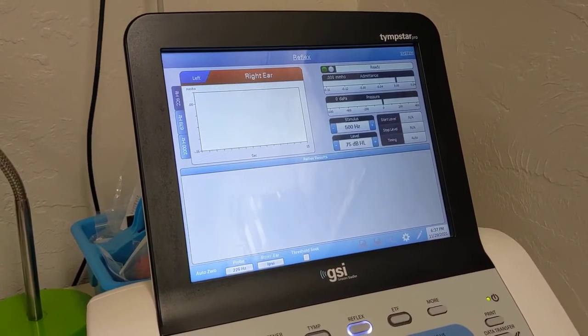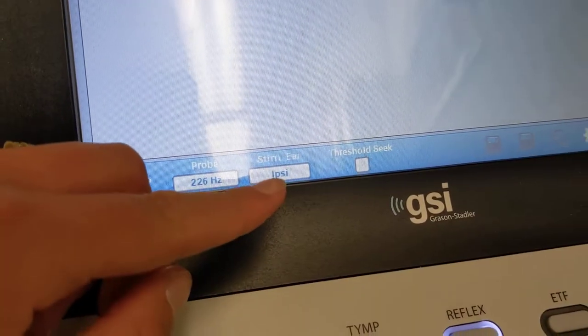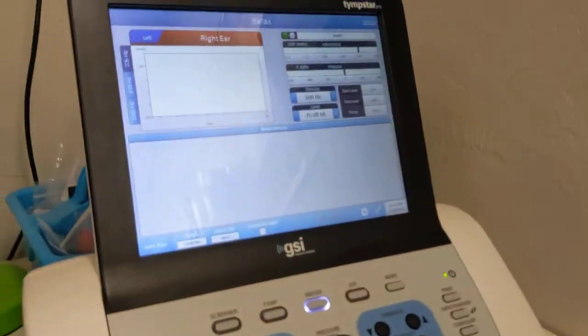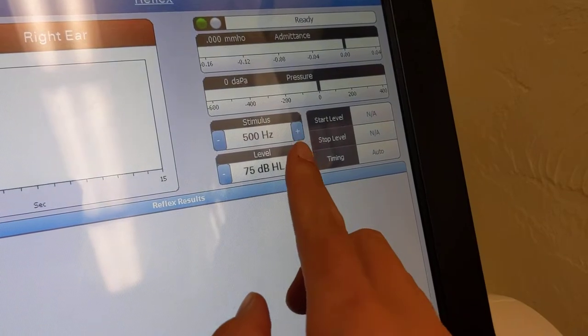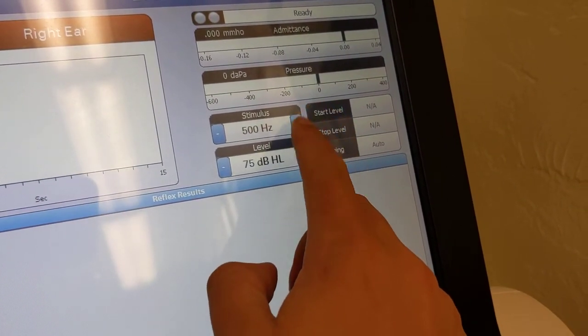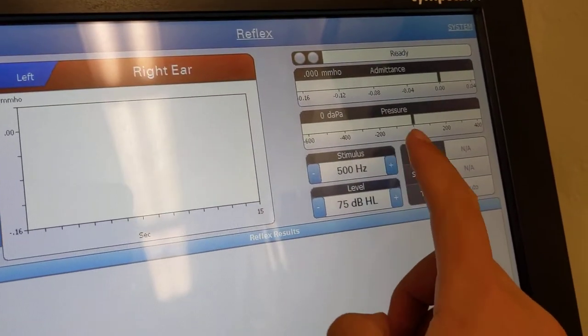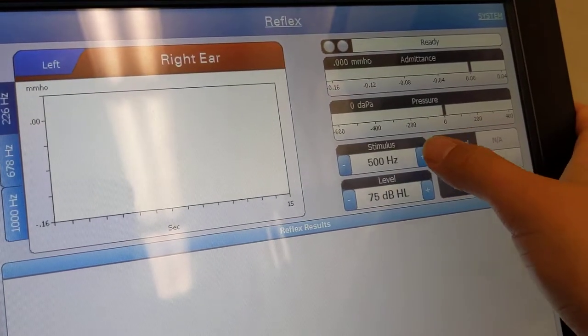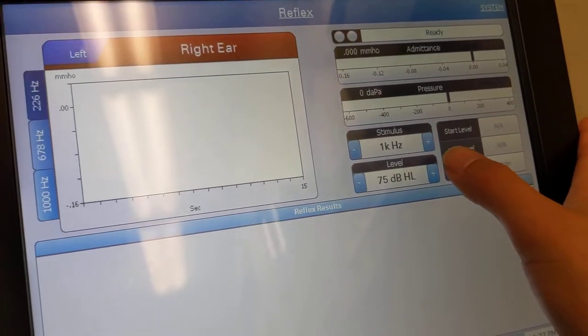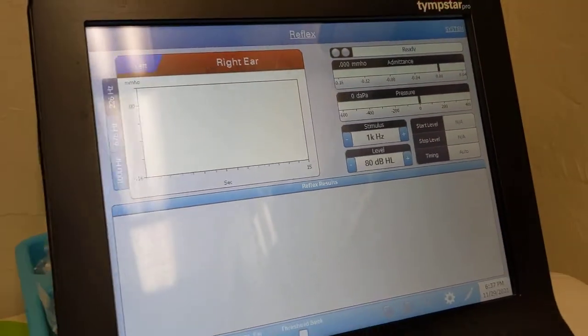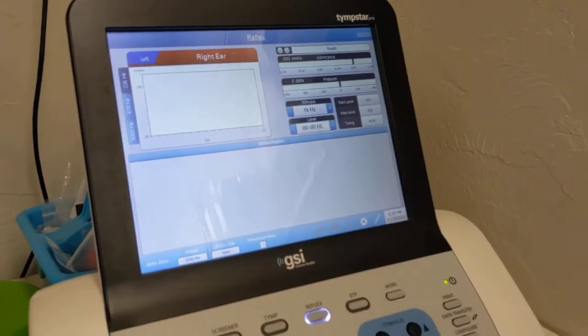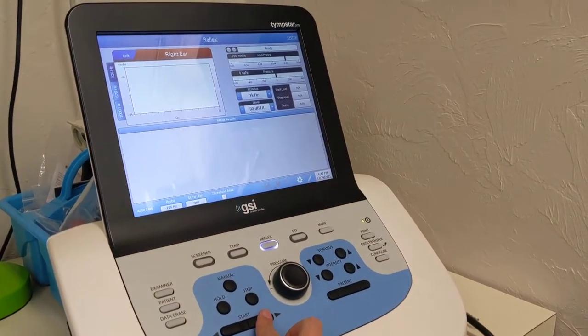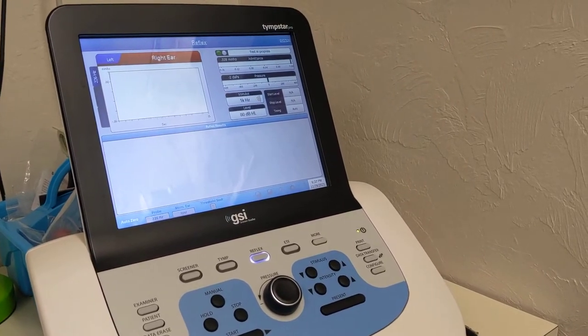And we have it set up for Ipsy, as you can see here. So I'm gonna put my stimulus at 1000 and we'll just start at 80. And I'm gonna press start and then present.